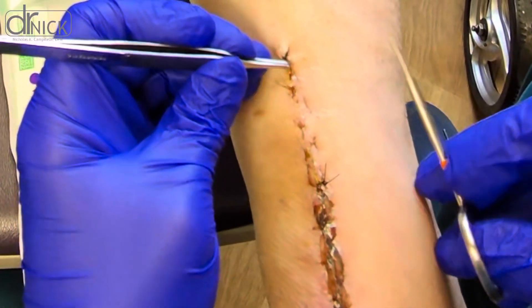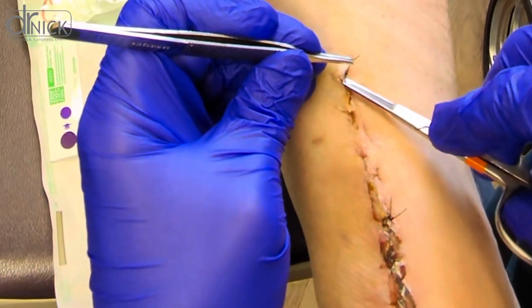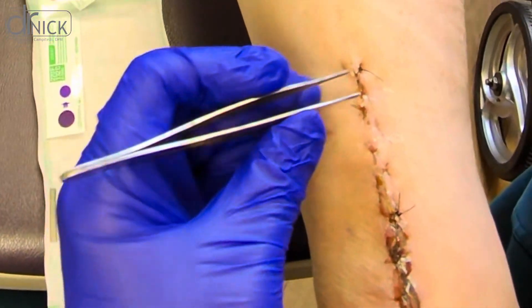Today I'm going to show you how we remove sutures from a repaired Achilles tendon after surgery for a ruptured tendon.